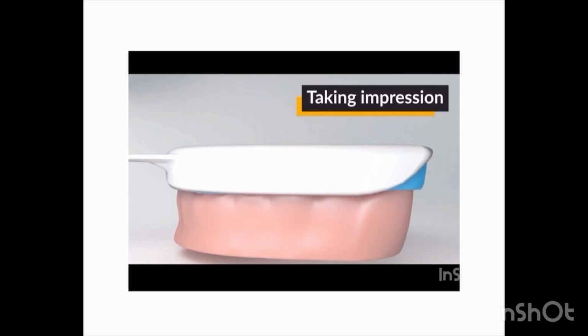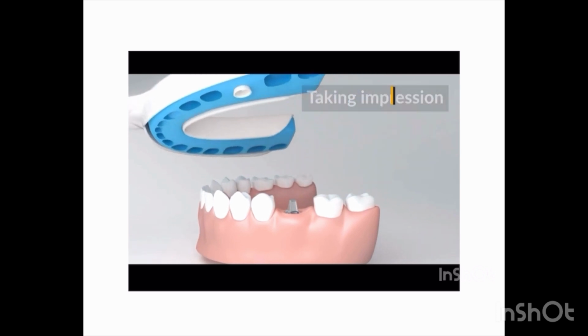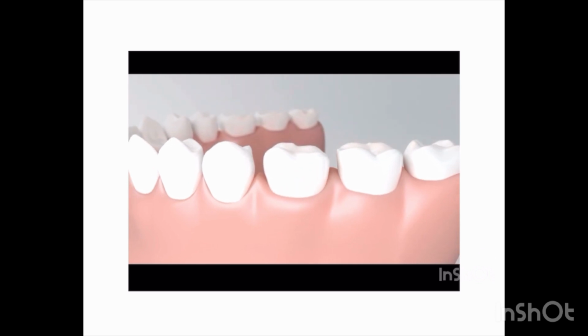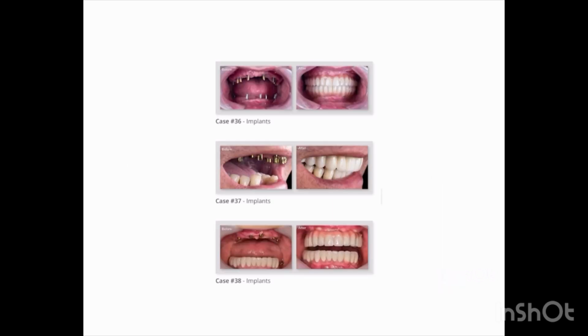At first we will take the impression, and then study models will be prepared. We will fit the crown. This is how an implant is done. These are some cases.